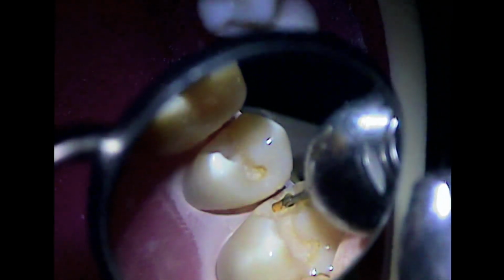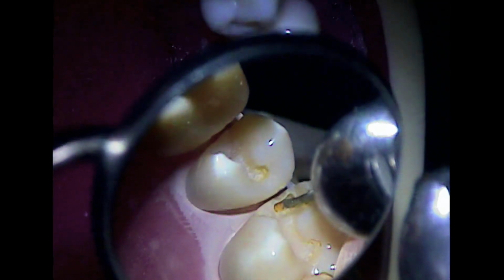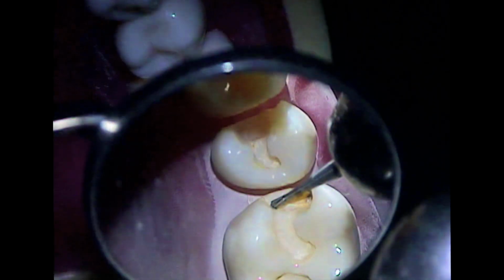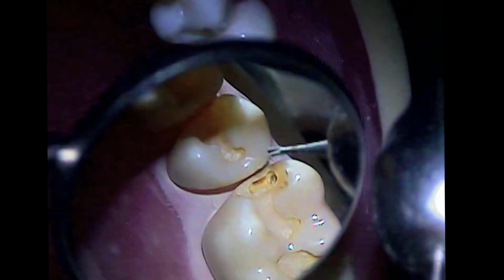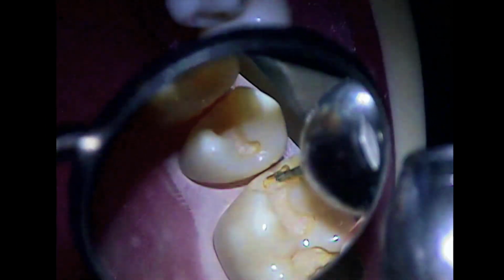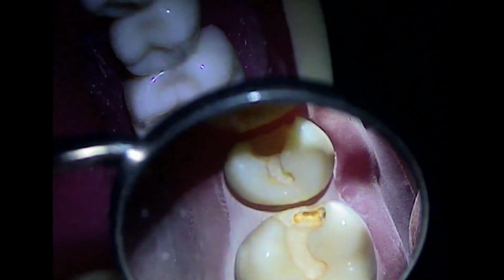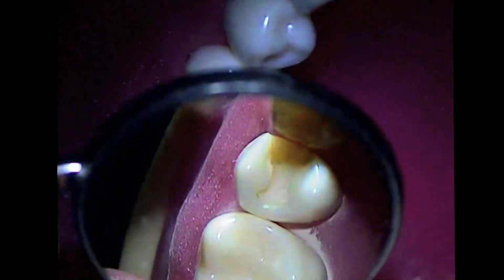But again, you could have had your axial a little bit more under control. It's not all that deep axially, but deeper than it really should have been or could have been. But I had clearance, so I didn't go more. No, I'm talking about axial depth. I'm talking about the position of the wall axially. I'm not talking about gingival clearance. I'm just showing you, by going gingivally, where the axial could have been. Okay. All right. Anyway, not too far off.